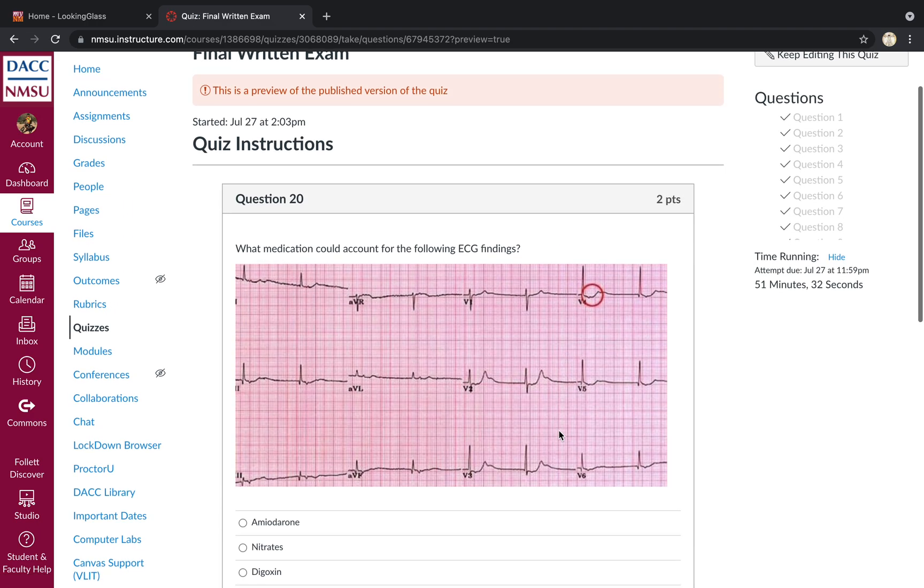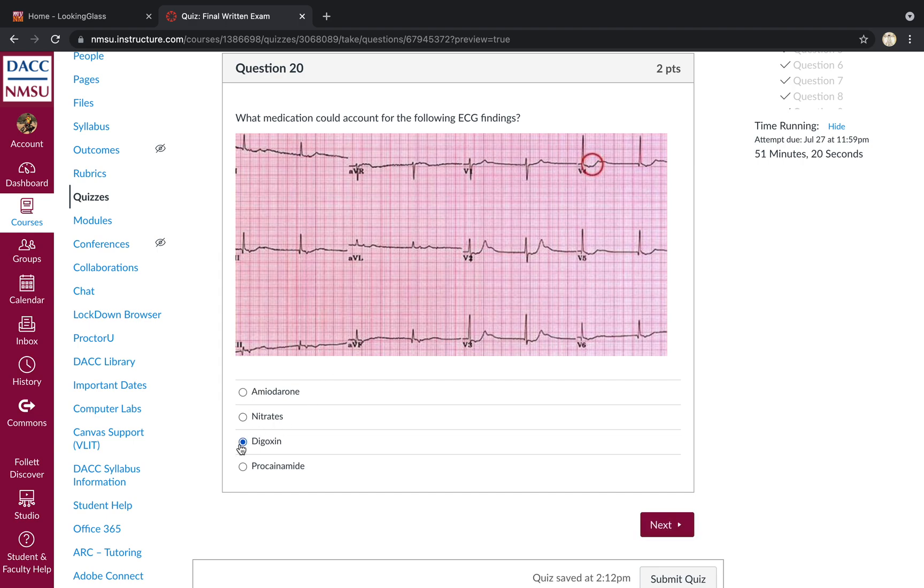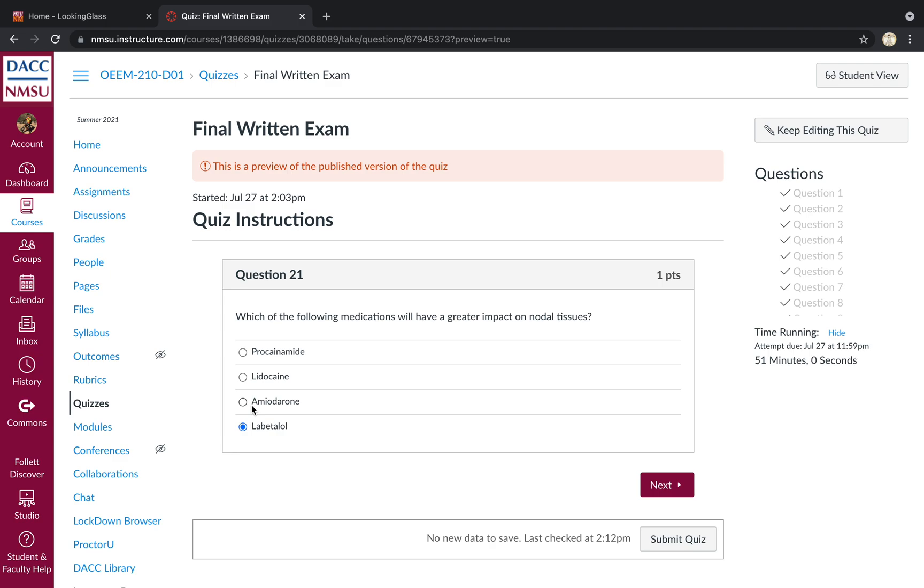Question 20, rather. Which medication could account for the following findings? So you see this nice, shallow ice cream scoop pattern. I actually have it circled in the V leads here. That would be dig effect or digoxin. Which of the following medications will have greater impact on nodal tissues? Labetalol, right? So calcium channel blockers and beta blockers tend to affect nodal tissues, whereas your sodium channel blockers, your class 1, and your potassium channel blockers, your class 3, like amiodarone, tend to impact ventricular tissues more heavily.